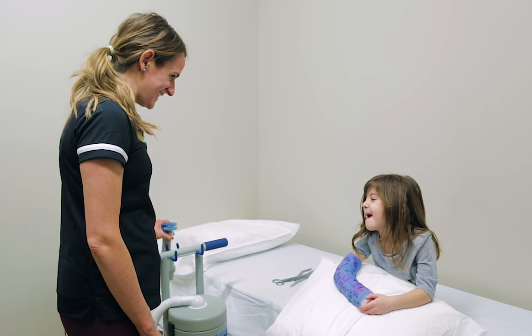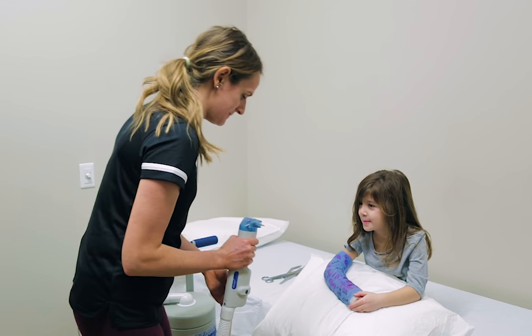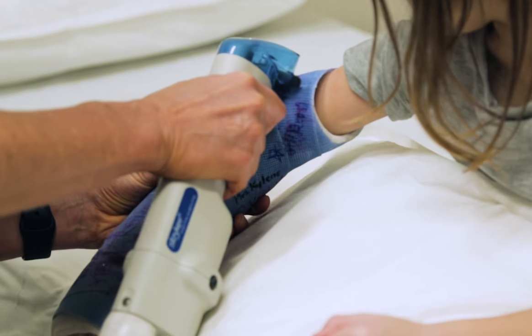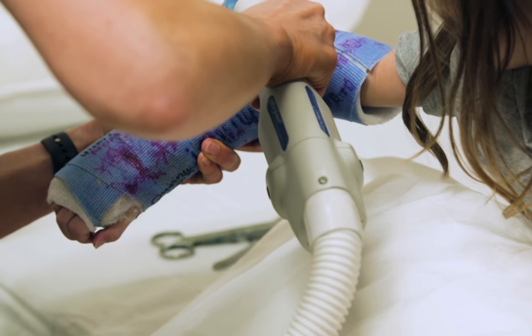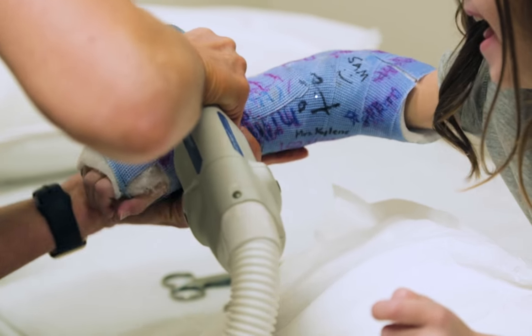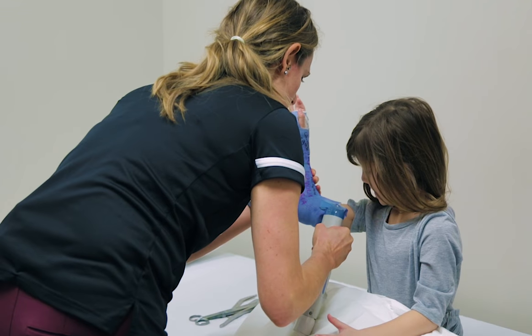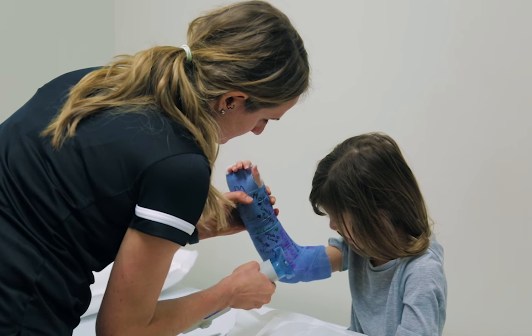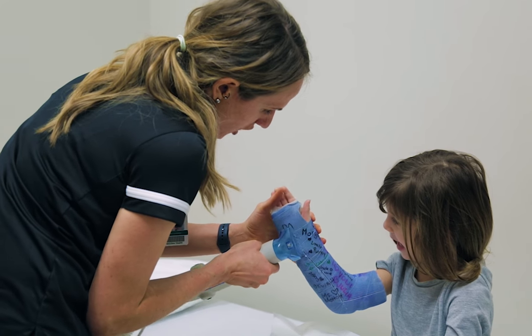All right, Hattie, are you ready? Like a vacuum, okay? We can start here. Almost done. Big hand.